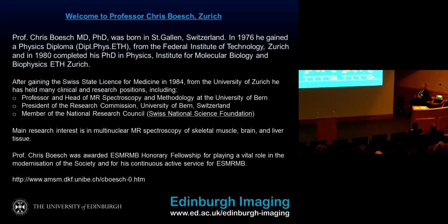IMCL, as I said, is a very dynamic metabolite. When we are exercising, we can reduce it within hours, and within hours and days we can replenish it by an appropriate diet. For example, this is a very illustrative example where we had one person doing 2 marathons, and before and after the marathon we had a drop of IMCL in 3 muscles: vastus medialis, intermedius, and tibialis anterior. Then with a low lipid diet, the replenishment was very slow. On the other hand, with a high lipid diet, one can see that it even has an overshoot, and we have a replenishment which is very strong and fast.